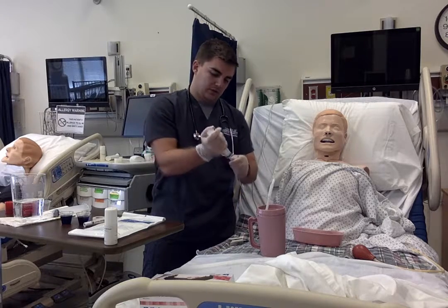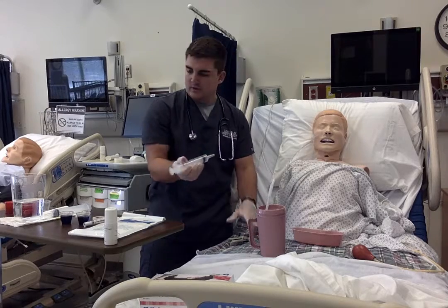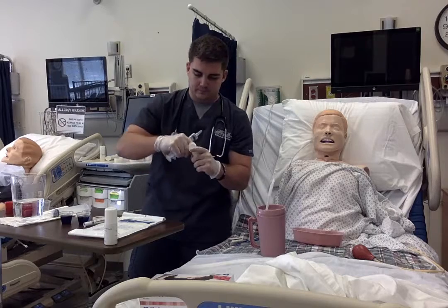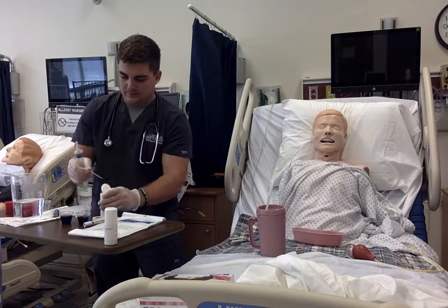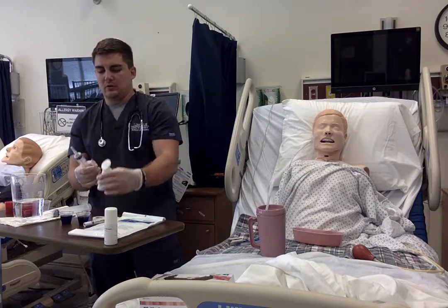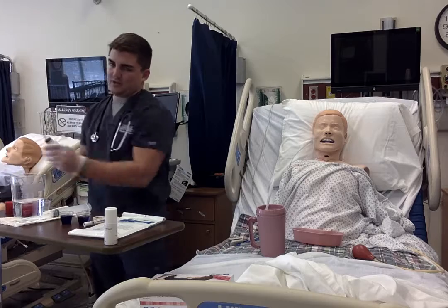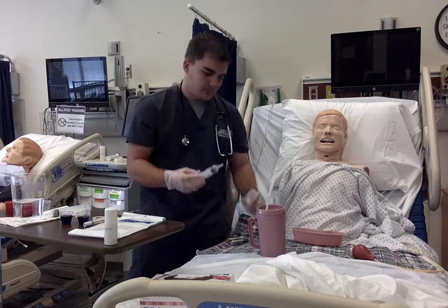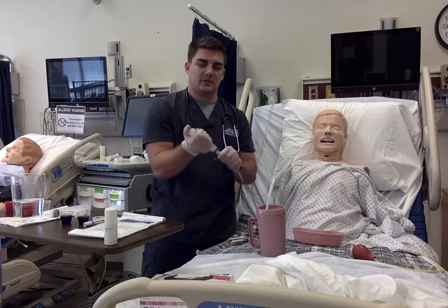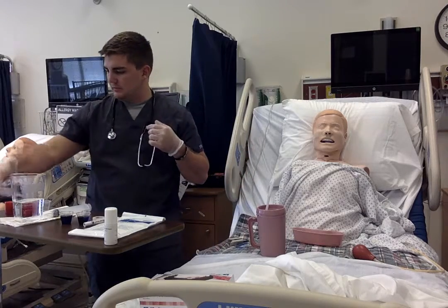After that, I could remove a few gastric contents, get a pH testing strip, put the contents on the strip, and compare it to what the pH should be. It should be very acidic, since it has gastric contents. The rest of the gastric contents I can instill back into the stomach, so it won't affect electrolyte balance and acidity.